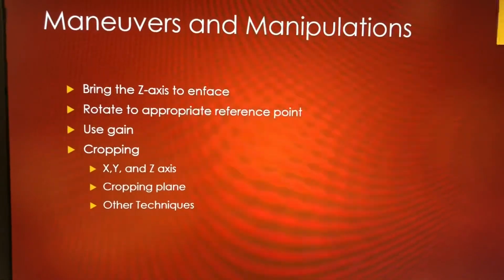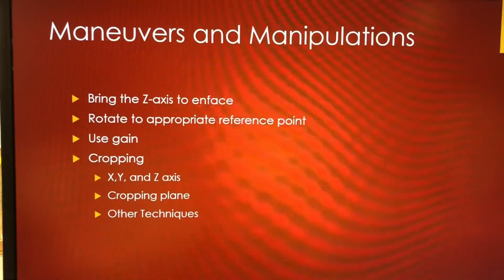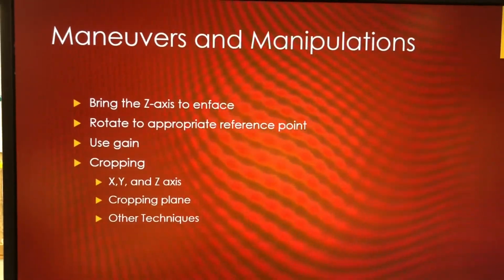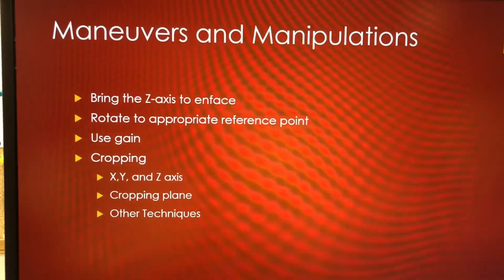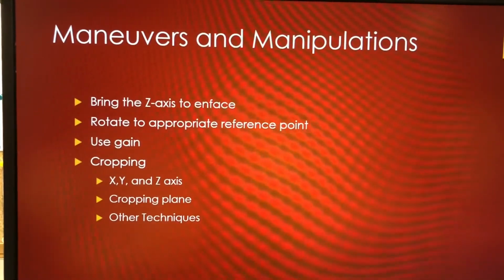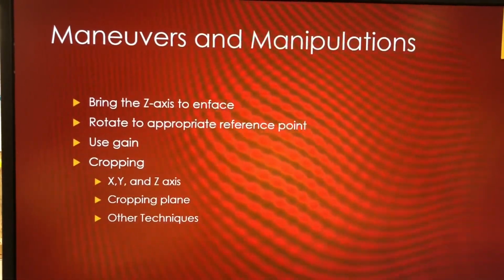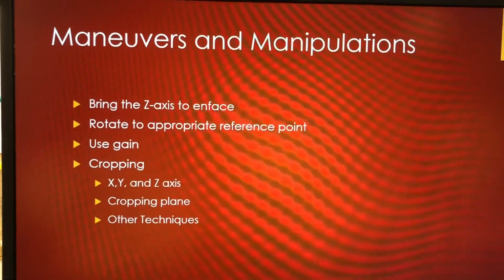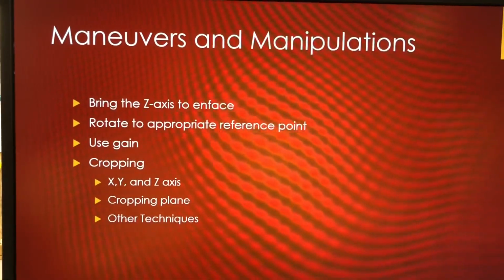So we'll use the z-axis to get the en face view. This is also called the surgeon's view, at least in relative terms to the mitral valve. So we'll bring it basically so we see it's almost like a smiley face. So we'll have the lateral on the left side and the posterior or medial on the right side of the screen.